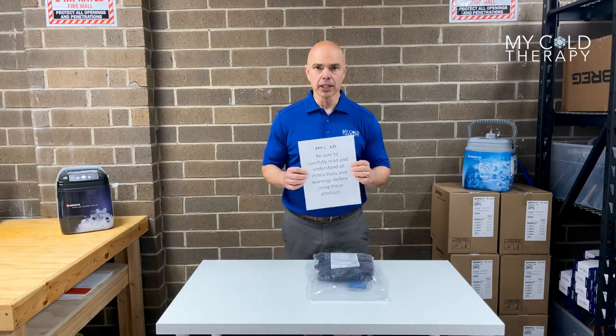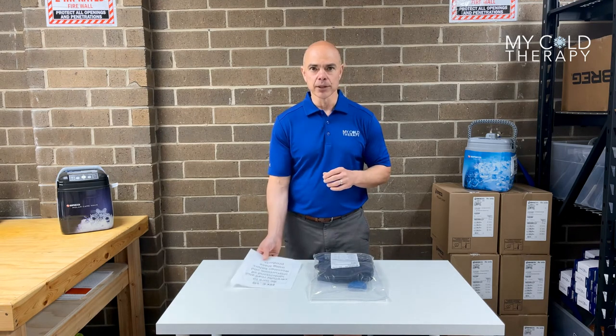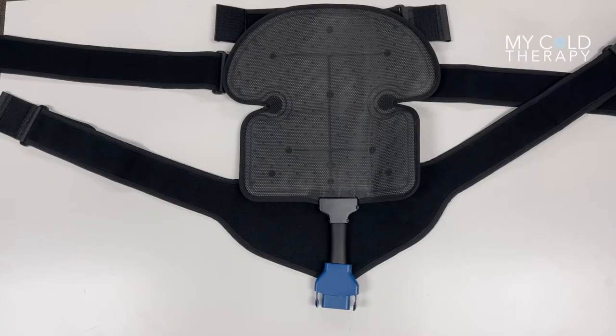Inside the box, please read all the instructions and warnings before using the machine. And now we're going to talk about the dimensions of the pad. This is the Breg Pollicare Wave Universal Pad.